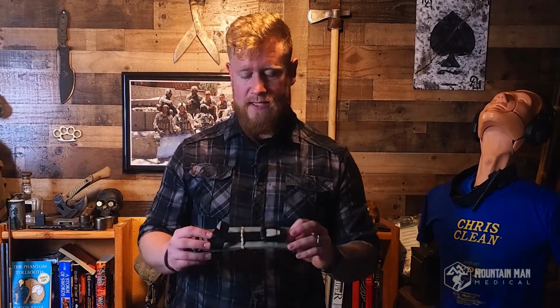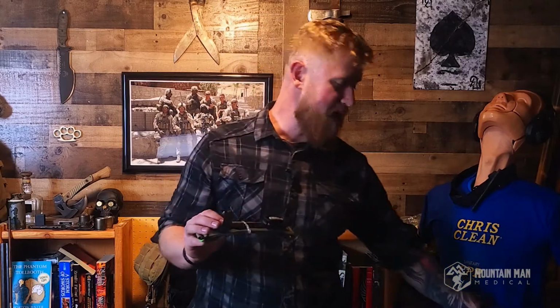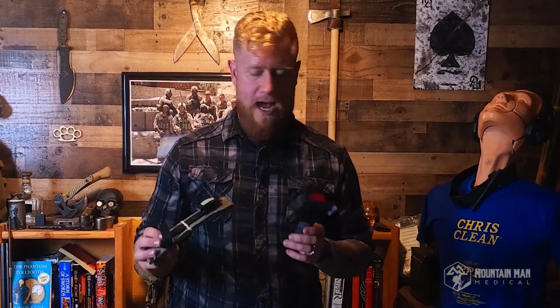And one of the things that I think the REVMedX lacks compared to the CAT is I think the CAT tourniquet is a little bit easier to put on. A little bit. I don't think it matters too much. It's probably more of a preference thing, in my opinion. I don't think that this is a lot more difficult or that you can't do it, or if you needed to apply it to yourself, you wouldn't be able to. But I would just think, in my opinion, there's a slight advantage to the CAT over the TX2.